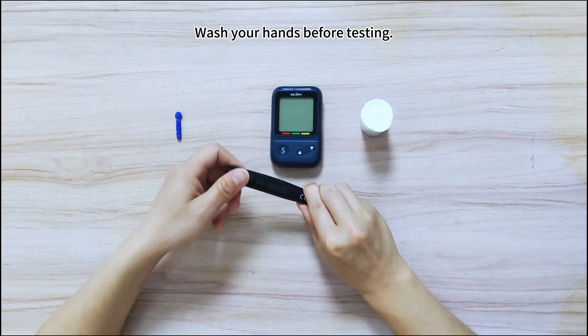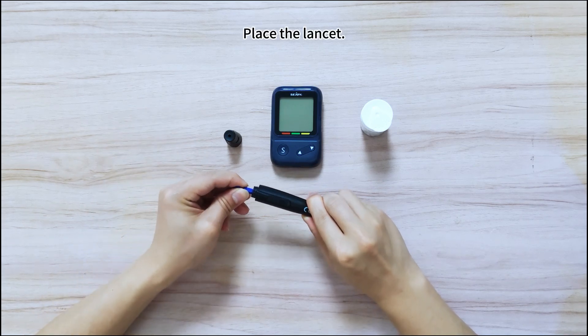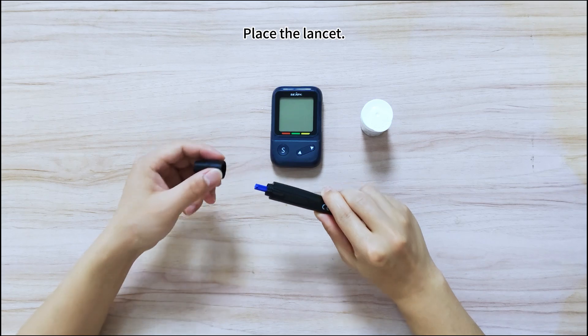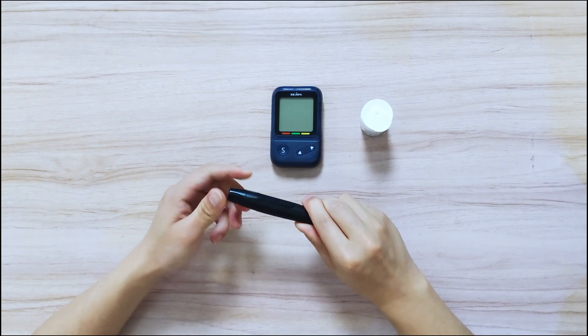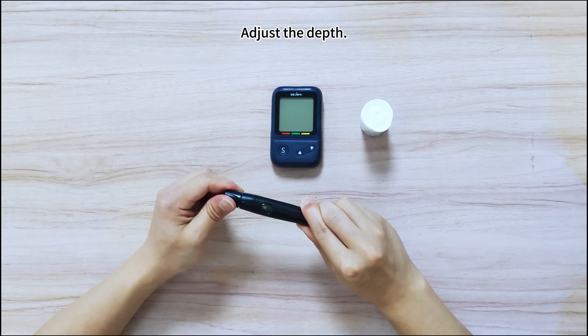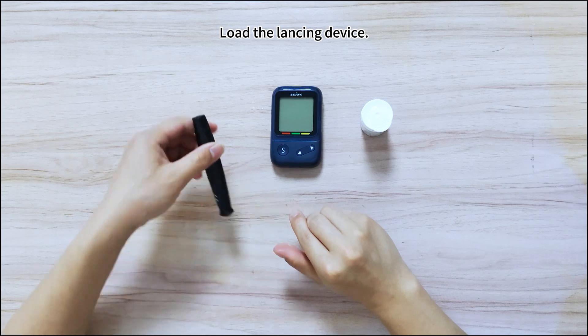Wash your hands properly and wait until they are dry. Put the sterile lancet into the lancing device. Adjust the depth of the lancing. Load the lancing device.